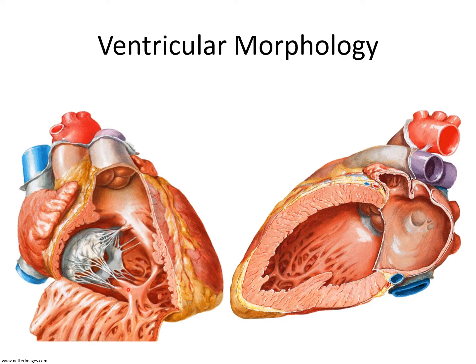These papillary muscles are all throughout the RV body, specifically on the septum and the free wall, even attached to the moderator band here. And the tricuspid valve, again, is a little bit more apically displaced than the mitral valve. In contrast, the left ventricle is a smooth-walled, mostly smooth, with fine apical trabeculations, no moderator band here.